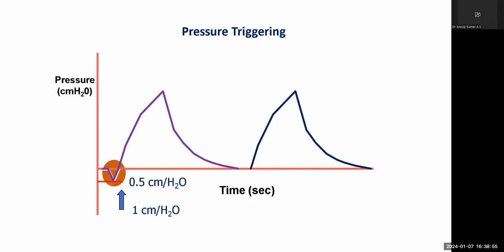So for practical purposes, you keep it at 2. See, all the efforts are getting triggered. At the same time, there is no auto triggering. Okay. If there are any issues with that, then we will have to adjust the trigger setting based on that.